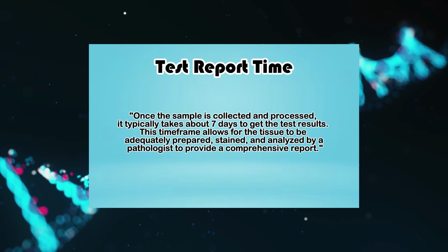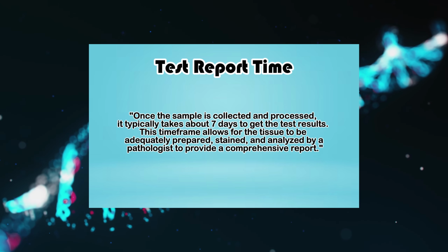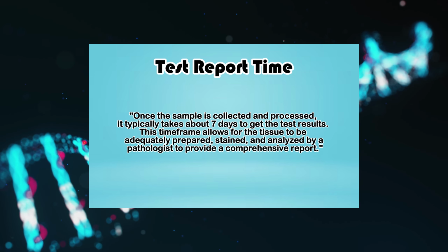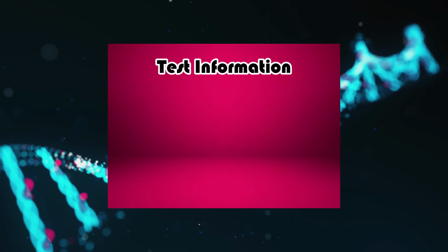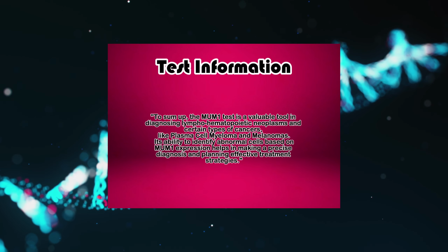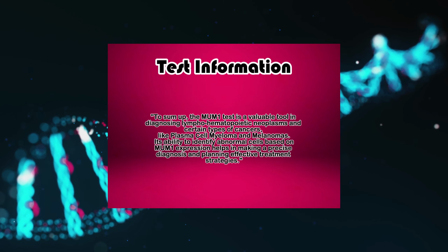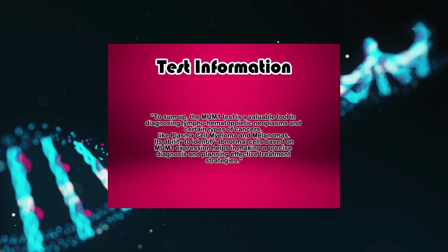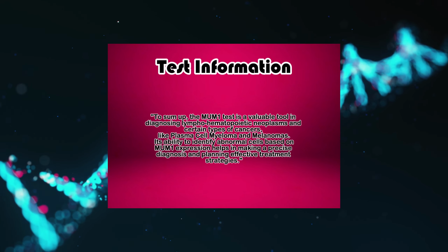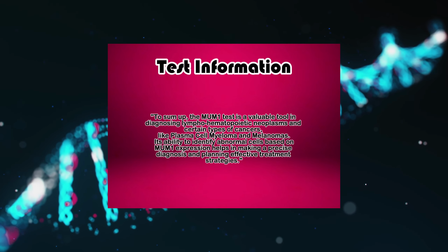test results. This time frame allows for the tissue to be adequately prepared, stained, and analyzed by a pathologist to provide a comprehensive report. To sum up, the MUM1 test is a valuable tool in diagnosing lympho-hemopoietic neoplasms and certain types of cancers, like plasma cell myeloma and melanomas. Its ability to identify abnormal cells based on MUM1 expression helps in making a precise diagnosis and planning effective treatment strategies.